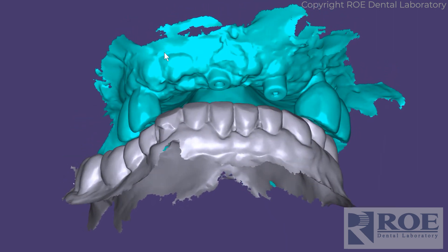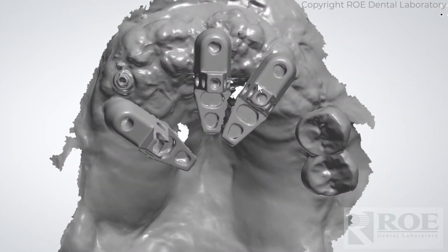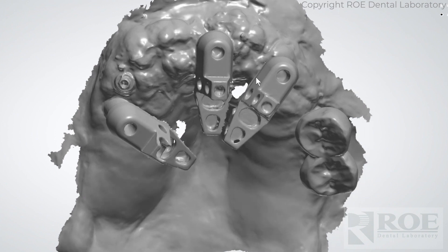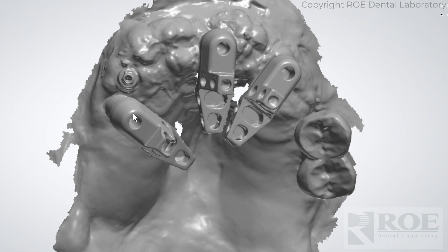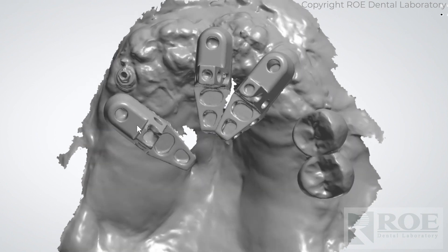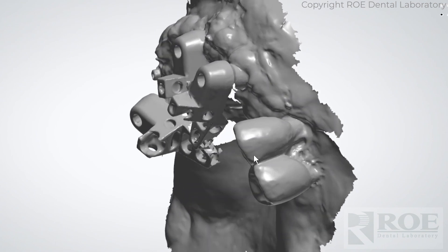Dr. Ford was pretty creative and figured this one out. What we did was add OptiSplints to these anterior two and place the implants here in these two sites, placed an OptiSplint here and then scanned. And then used these two teeth as the bite.